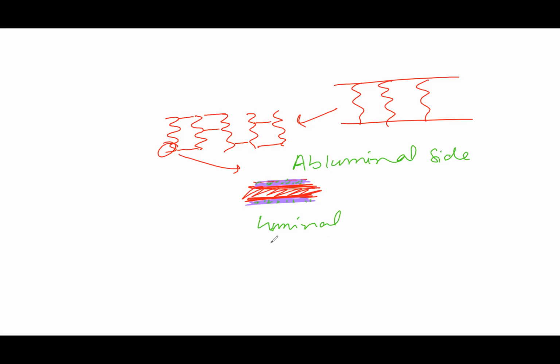Luminal. So the endothelium is on this side. I would think that as well, but the actual issue with the endothelium is that you don't want endothelium to grow on this side, because it's going to grow inside like grass between these holes. So the drug is actually more important to be here on the abluminal side, and this is what the Synergy does.